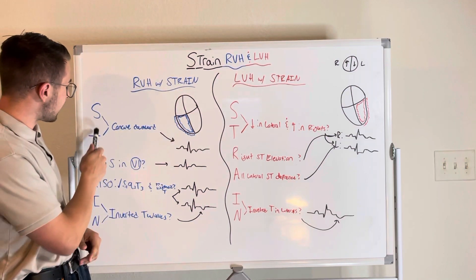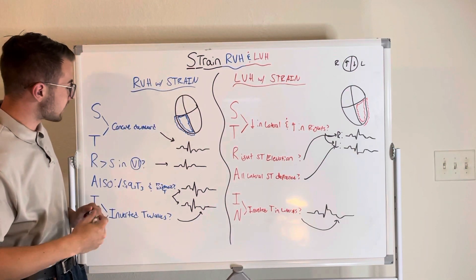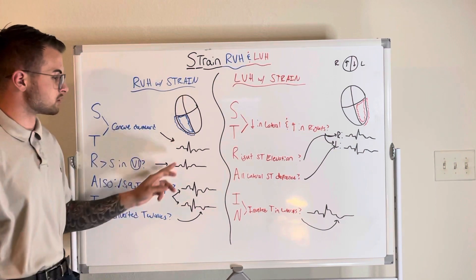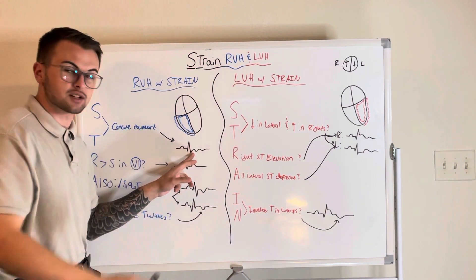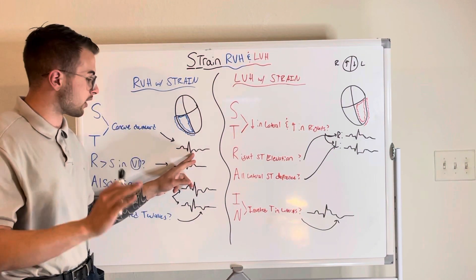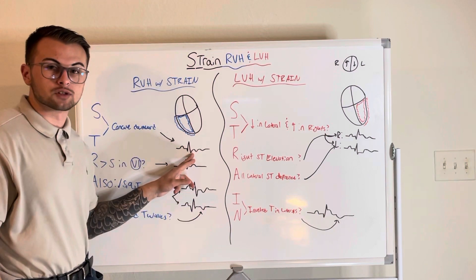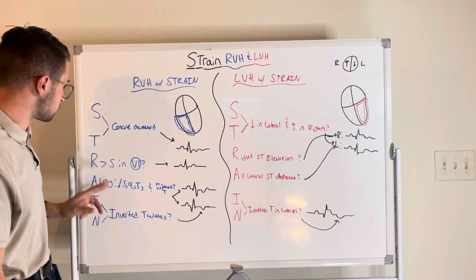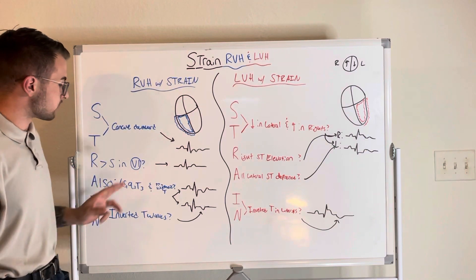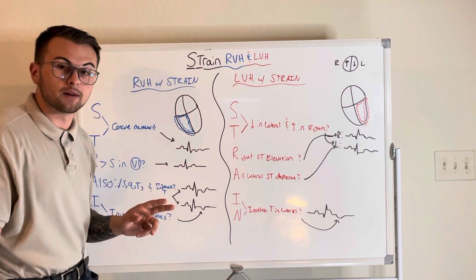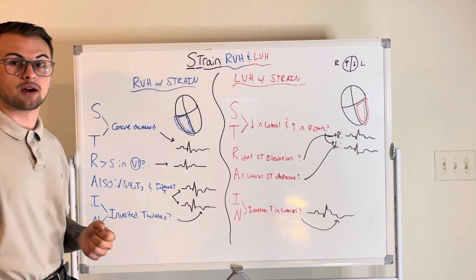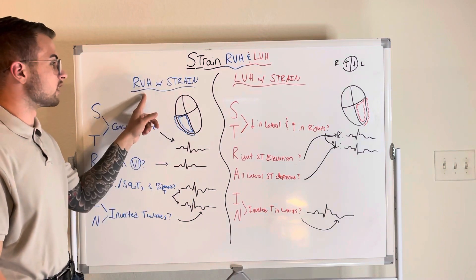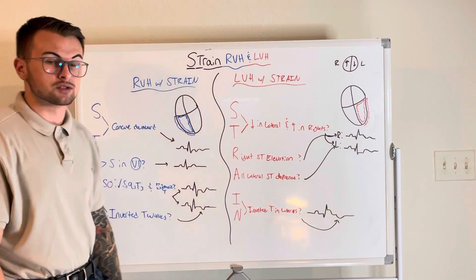The ST in STRAIN stands for ST concave downwards. As you can see here, it looks like somebody's taking a little ice cream scoop out of our ST segment — that's an indication of strain. The R stands for R that is greater than S in V1, which we know is the definition for right ventricular hypertrophy.